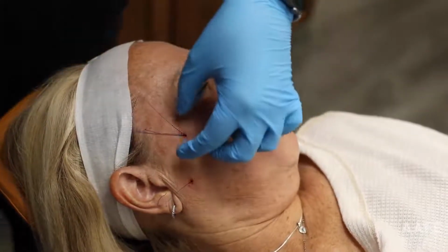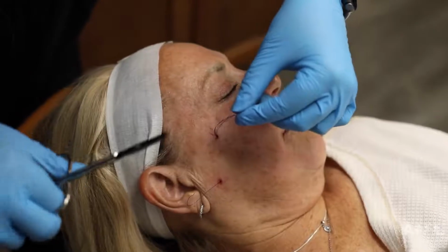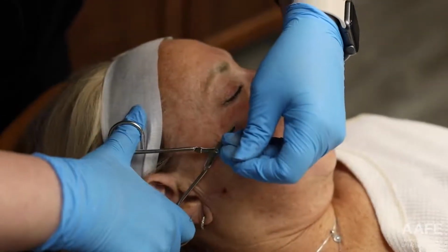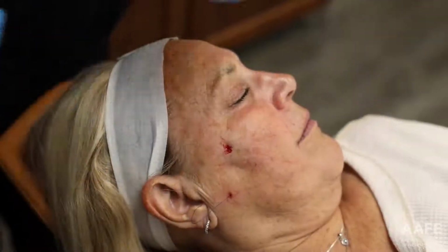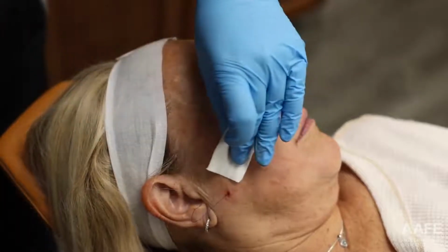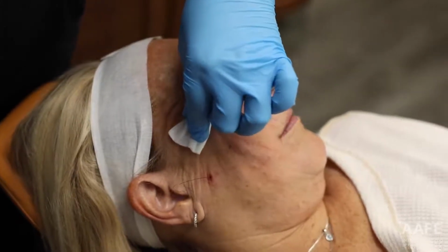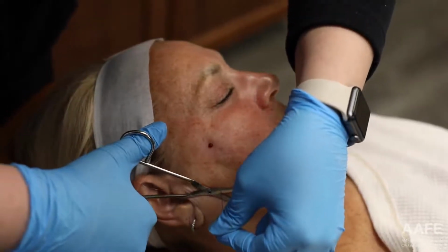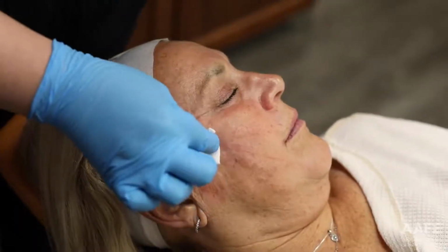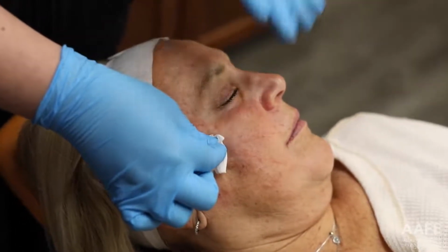So now I'm gonna take my scissors. I like to pull the threads straight up to the sky. Open my scissors really wide and kind of follow it down. You're not gonna hurt the patient. You wanna cut as close to the skin as you can so that the thread actually slips underneath the tissue and that nothing's sticking out, so that area can heal over nicely. Same with this one, straight up to the sky, push down and trim. Just hold some pressure here. And then I just like to alcohol her face off really well again and apply Band-Aids.